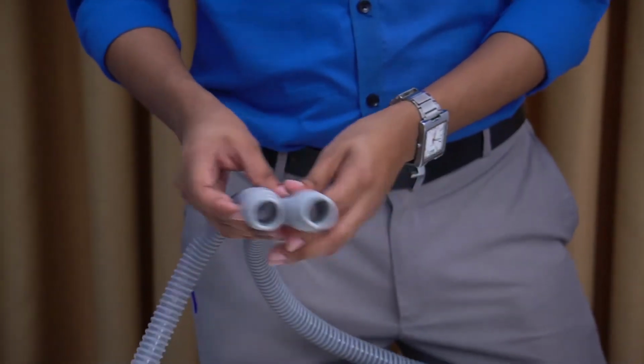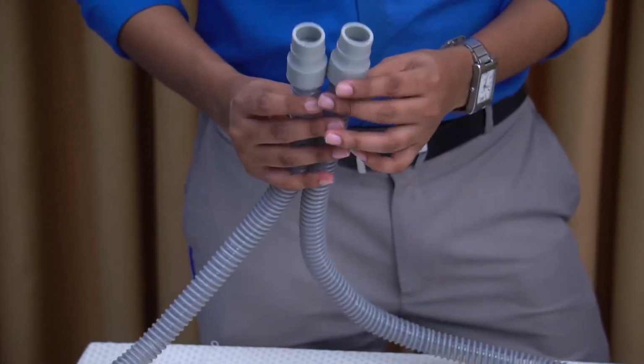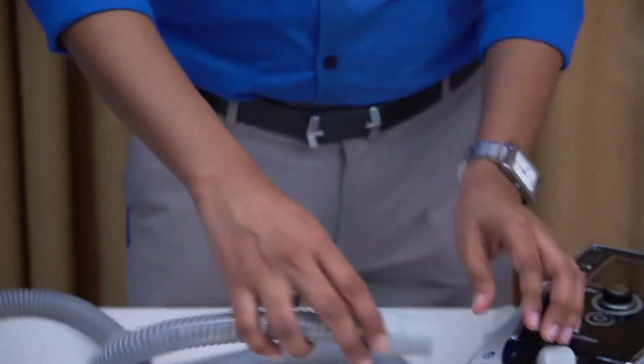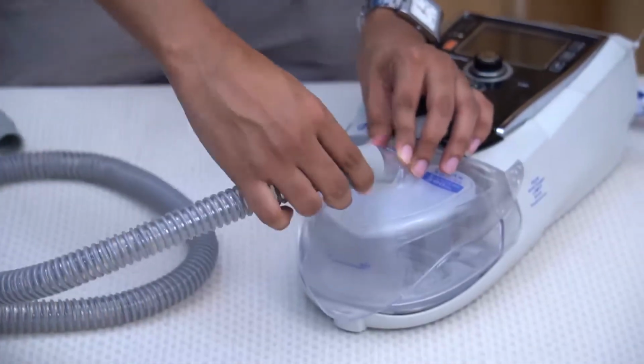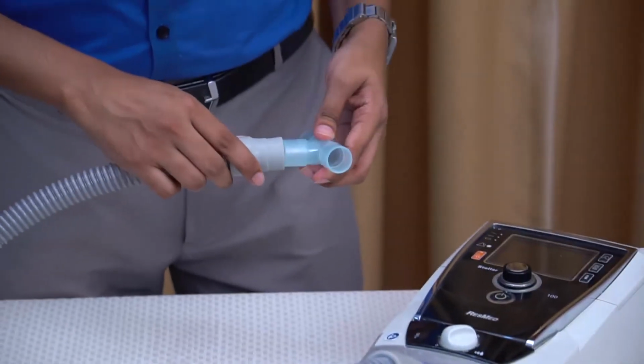Tubing. This equipment has a single tube. Both ends of this tube are the same. One end connects to the port in the humidifier, and the other end connects to the patient interface, which is the face mask.